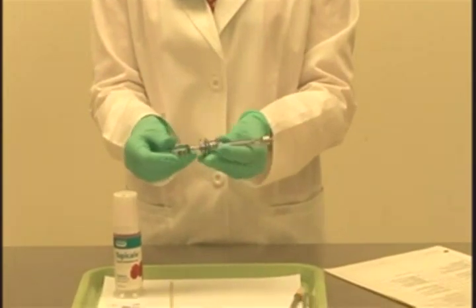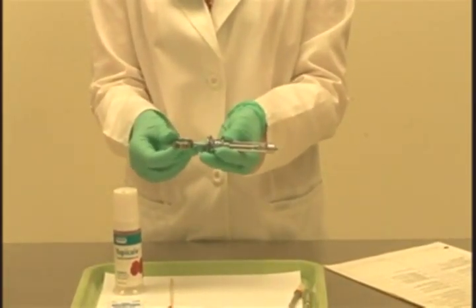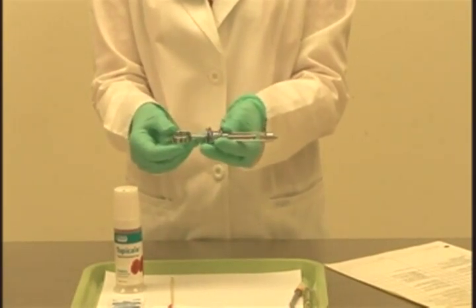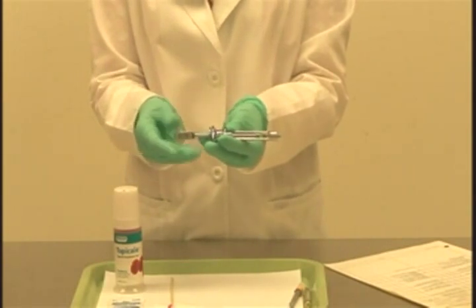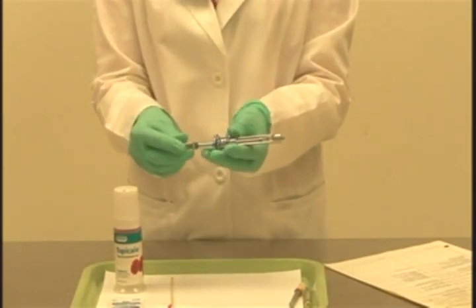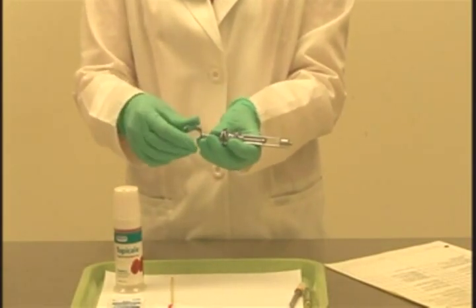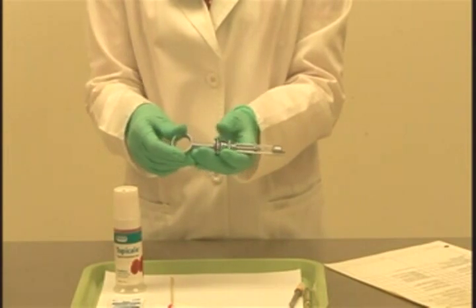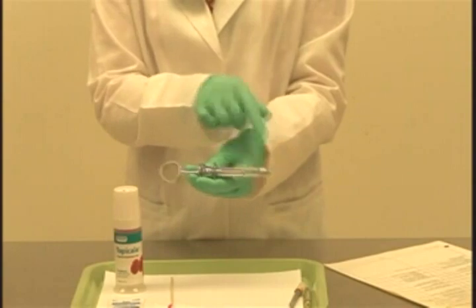Those are the four parts to check with this particular syringe. There are other types of self-aspirating syringes on the market where you may not need to check those four areas. But for our clinic procedure, you will be demonstrating that you can identify and tighten all four parts: the thumb ring, the finger grip, the piston, and the needle adapter.